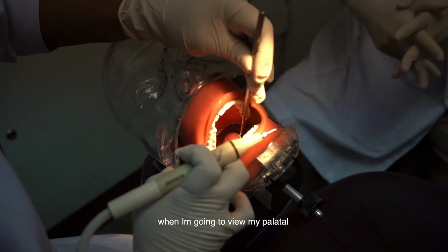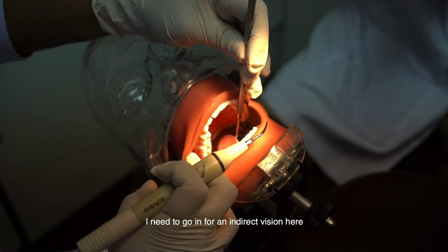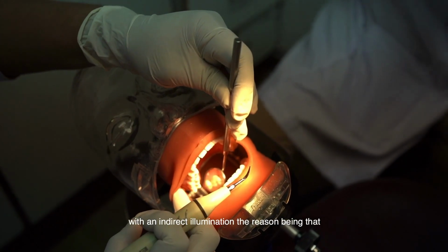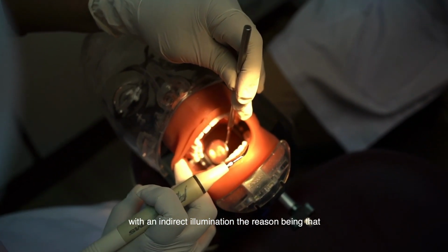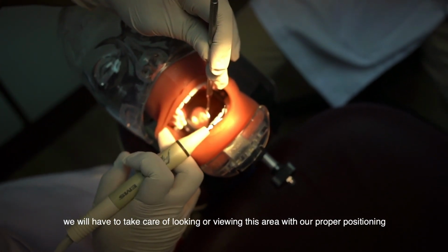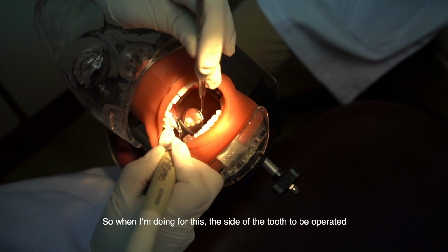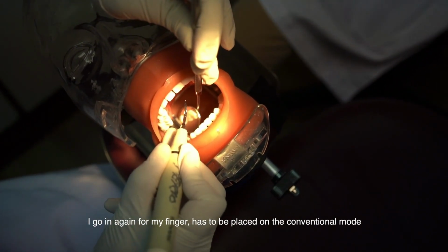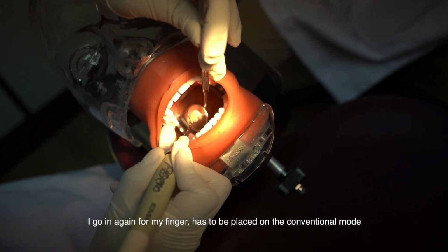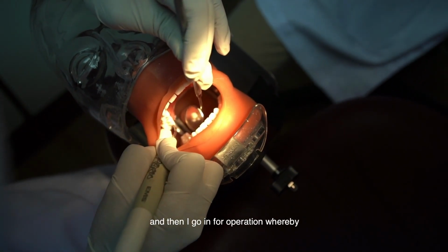When I am going to view my palatal, I need to go in for an indirect vision here with an indirect illumination. The reason being that we will have to take care of viewing this area with proper positioning. So when I am going for this side of the tooth to be operated, I go in again for my finger rest to be placed in the conventional mode, and then I go in for operation.